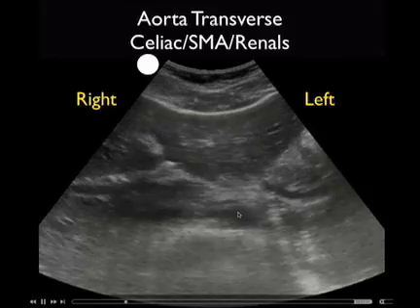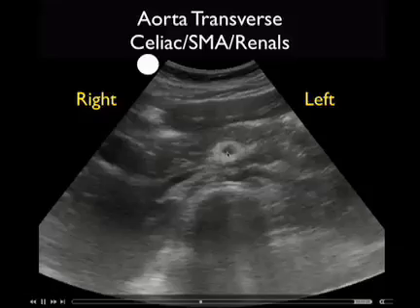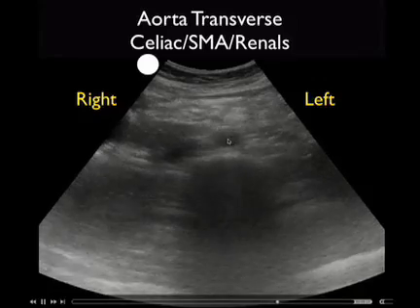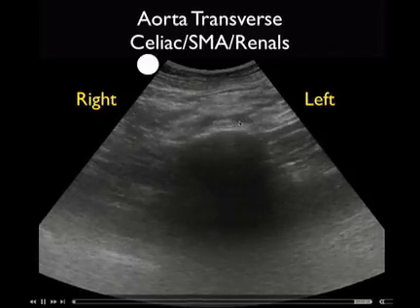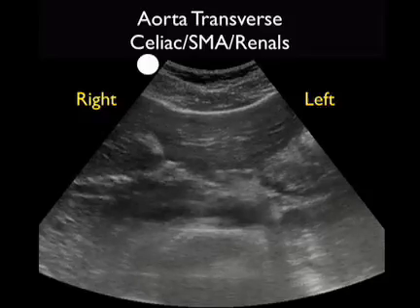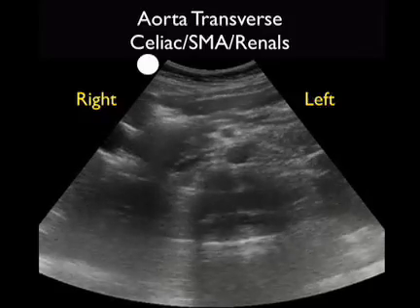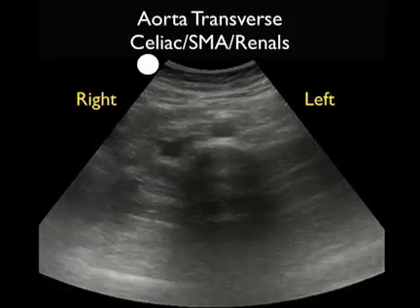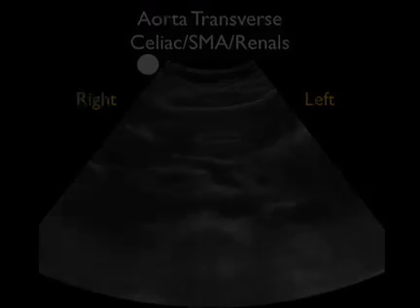Here we're going to put it all together and start from a position high in the abdominal aorta, and there's the celiac axis, next superior mesenteric artery, there renals, and notice that the abdominal aorta becomes more superficial as it moves more inferiorly. And we see here the bifurcation into the paired iliac arteries. So again, from the top, we see the celiac or seagull, moving down, the SMA, and there's the renal arteries. And here we're looking as the abdominal aorta becomes more superficial, and there's branching into the paired iliac arteries. So a complete aortic exam.